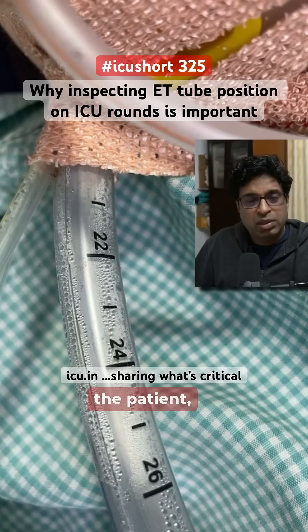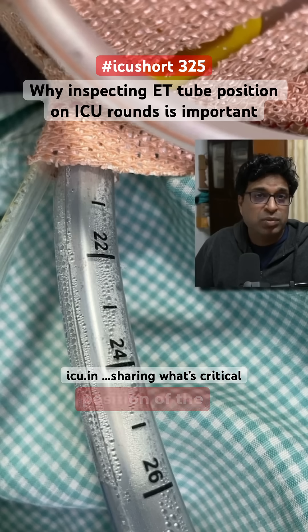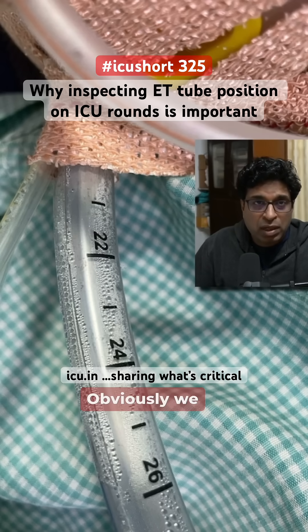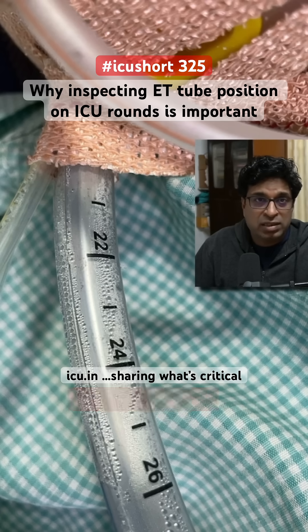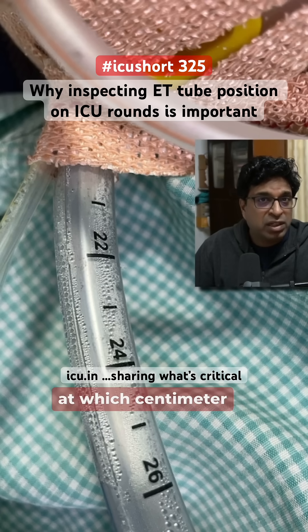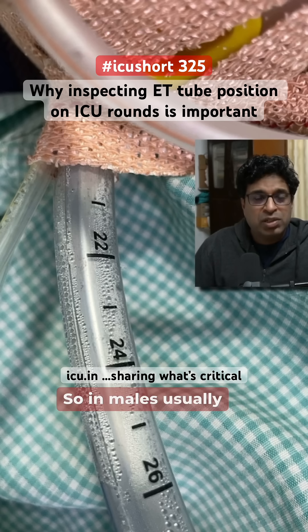Whenever you take rounds of the patient, always inspect and check the position of the endotracheal tube at the upper lip or incisor level. We will confirm the position by chest X-ray, but you cannot take a chest X-ray every now and then. Always check at the incisor level at which centimeter it is fixed. In males, usually fix at around 21 to 22 centimeters; in females, somewhere around 20 to 21 centimeters.